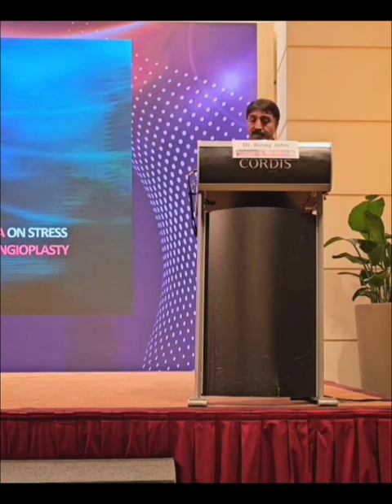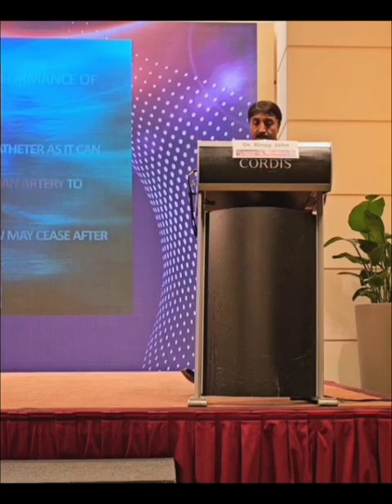The case which I am going to show is a LIMA kink, which showed significant ischemia on stress myocardial perfusion imaging in a patient who presented with angina, and it disappeared after the angioplasty. So you can see this is a kink. There's a whitish shadow just at the bend, just below that stent. You can see there's a circumflex stent there. So this was a case which I did in 2012.